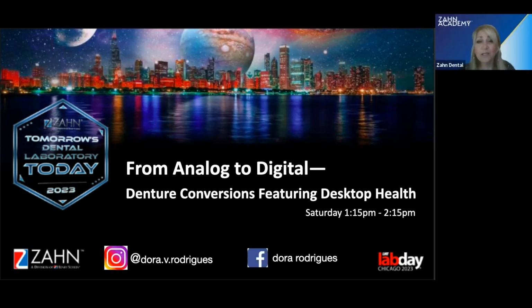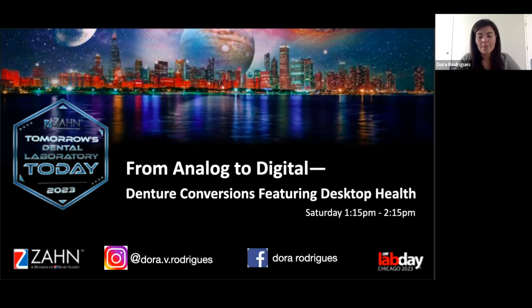Darius wants to know, how about denture relines? So I don't do dentures, so I don't do relines. But if I use Q resin for my conversions, and for some reason we need to reline a denture the same day because we cannot load, I would use that material because it has the bonding. It bonds really well with either printed dentures or acrylic. I know there are some doctors that talk about some materials that are good for printed dentures, but I don't know that. But if you have a denture and it needs to be relined because you cannot load that same day for some reason, Q resin is a good material to use because it bonds to the printed denture really well. And that's what I use for my conversion.